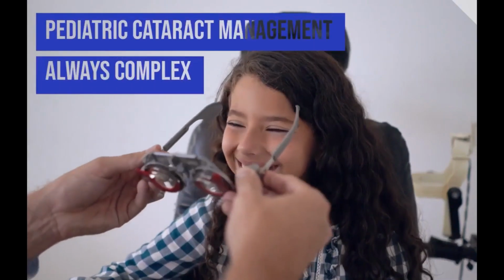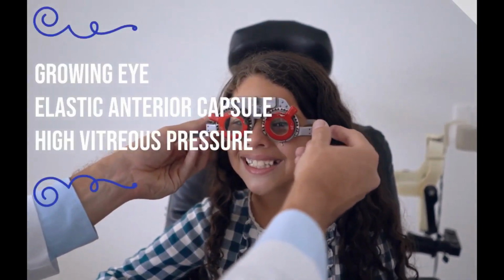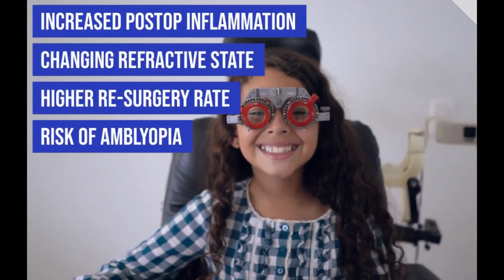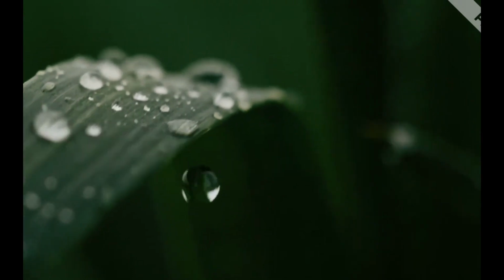Pediatric cataracts by themselves are complex to manage because of factors like a growing eye, elastic anterior capsule, increased chances of post-operative inflammation, changing refractive state, and the risk of amblyopia.